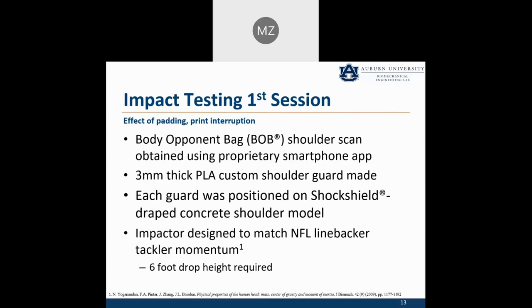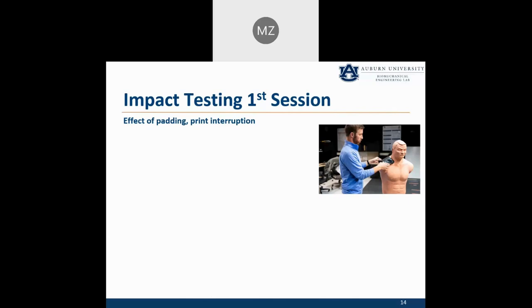So we're thinking worst case scenario, what does an NFL linebacker tackle look like? Let's impact this shoulder guard with that amount of momentum and that amount of energy, and let's see how it holds up. So here I am placing the guard on this body opponent bag. You can kind of get the idea of what the setup looks like.